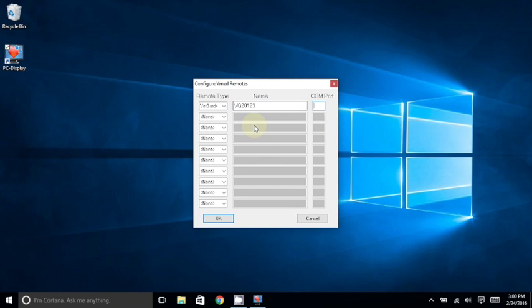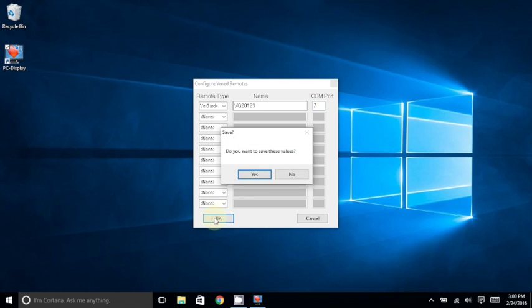And then in the box to the right of this, enter the number that we noted earlier from the Bluetooth Settings window. Finally, choose OK, and then Yes to save these values.